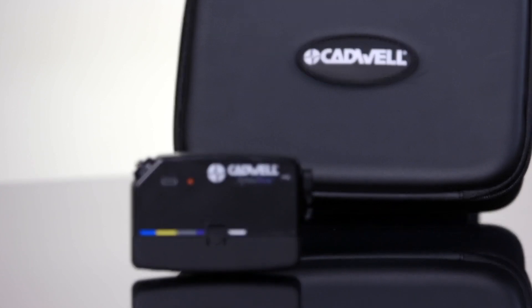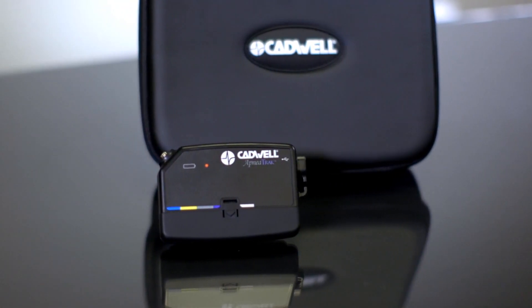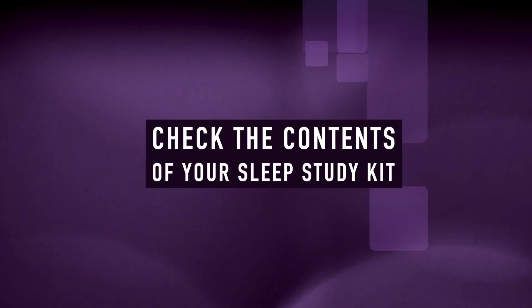Your healthcare provider has determined that you will participate in a home sleep apnea test. The Cadwell apnea track will collect data on your breathing and snoring while you sleep. If your provider gave you specific instructions, follow those instructions first. As you prepare for your home sleep test, please check the contents of your kit.